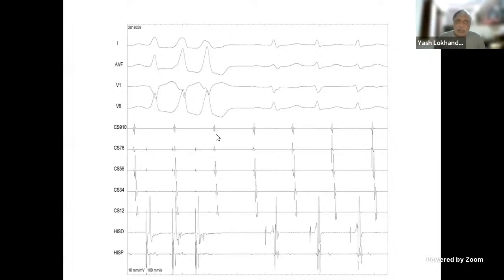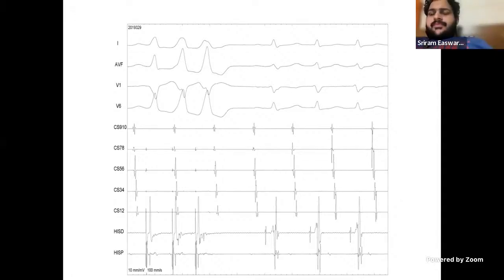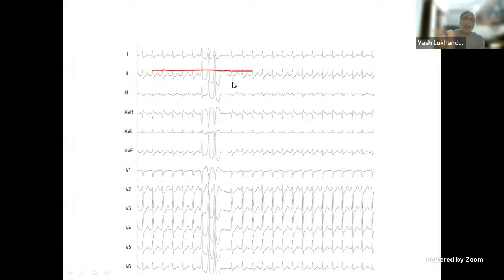The tachycardia continues. So which type of tachycardia is most likely over here? Dr. Umesh, Ram, anyone else? Yagnik? The atrial tachycardia. Okay, very good. So most likely this is atrial tachycardia. Now can we go to the surface ECG, the previous slide, and say that, suppose I say AVNRT. In AVNRT, you can have a short period of AV dissociation. From the surface ECG, can you rule out AVNRT?